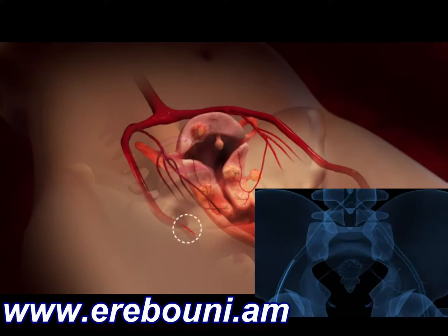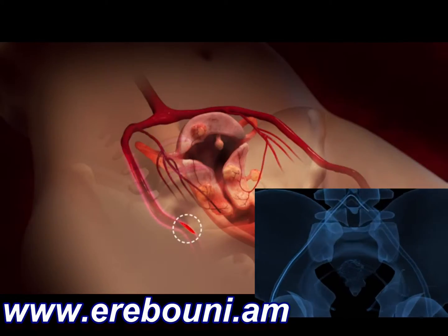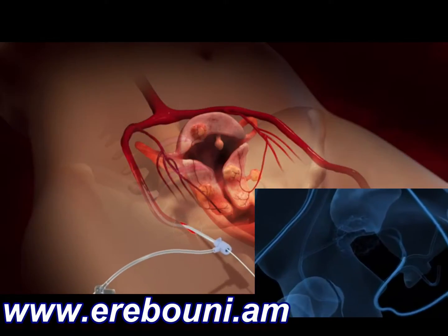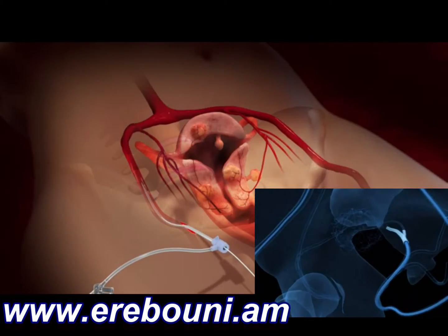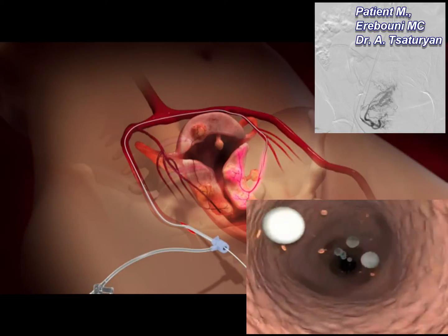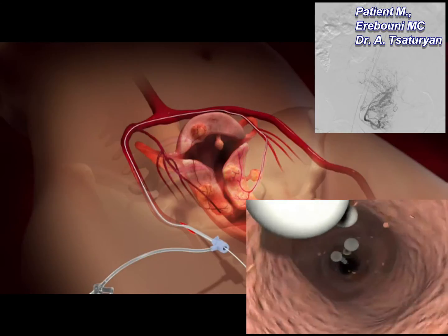A small incision is made in the leg to gain access to the femoral artery. A long flexible tube called a catheter is then inserted into the femoral artery. It is guided up the femoral artery and into the artery that supplies blood to the uterus, called the uterine artery. The catheter is then guided to smaller arteries that supply blood to the fibroids.